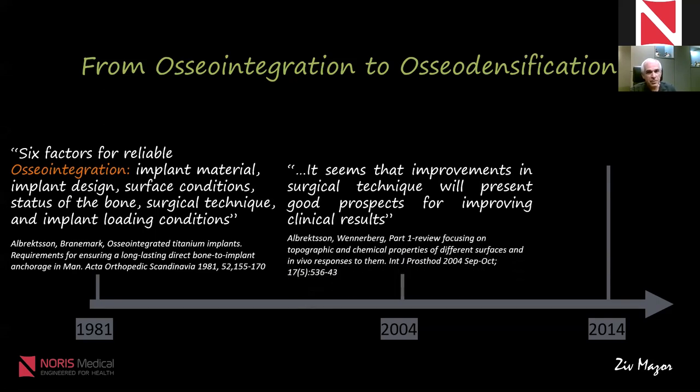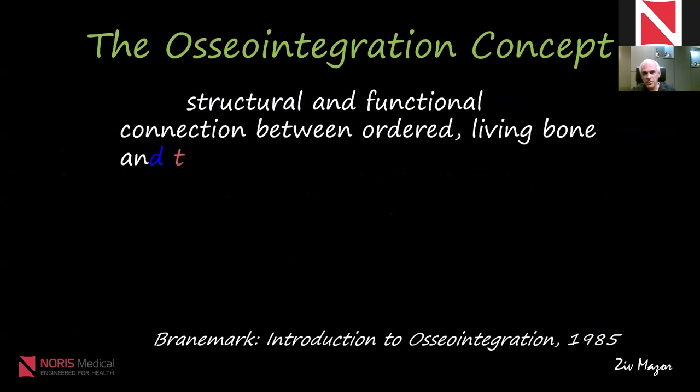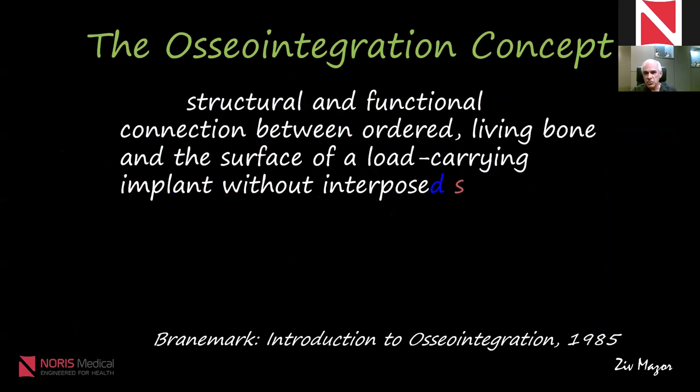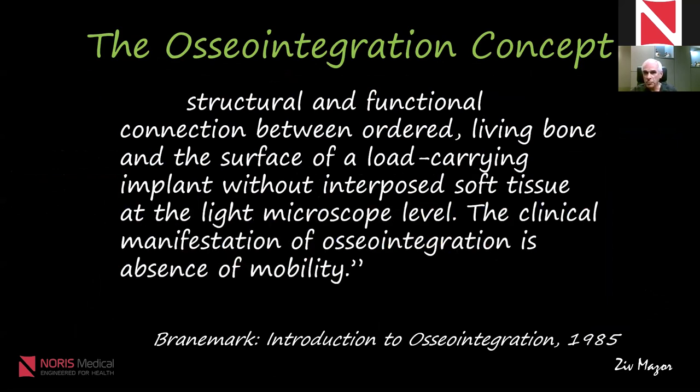And what is the improvement in our surgical technique over the years from 2004? It came out just a decade later, in 2014, when osseodensification came into the implant arena. Now, as for the osseointegration concept, this is a structural and functional connection between ordered living bone and the surface of a load-carrying implant without interposed soft tissue.